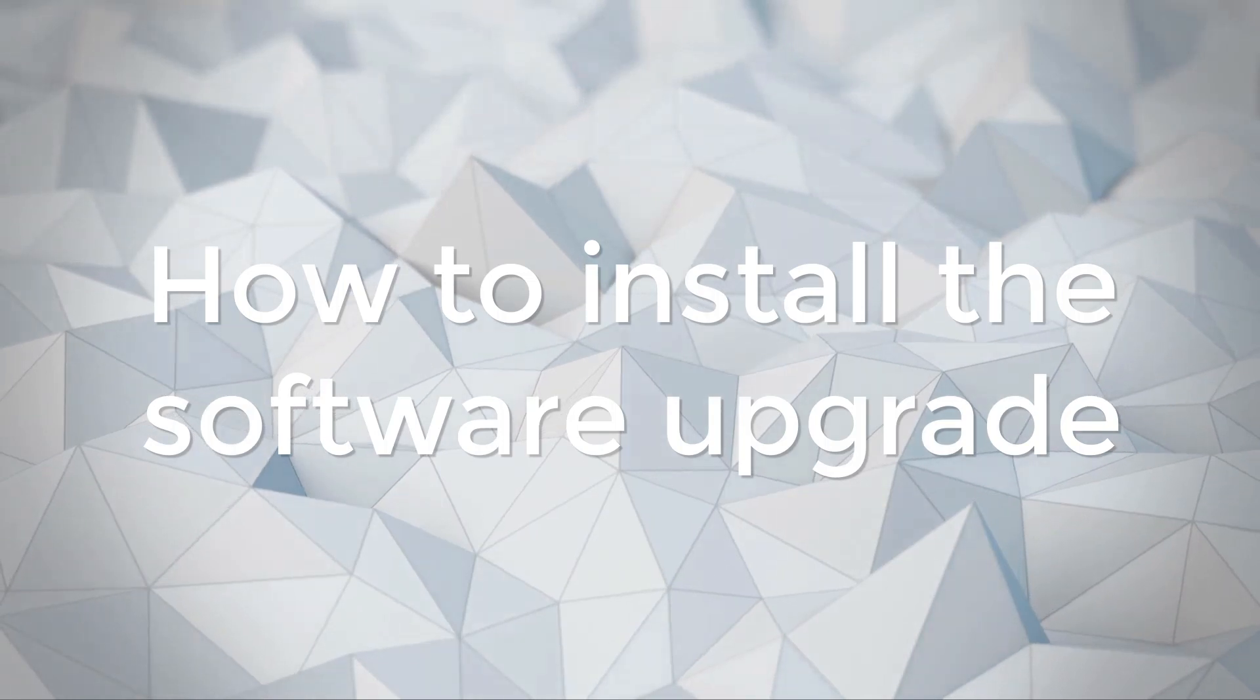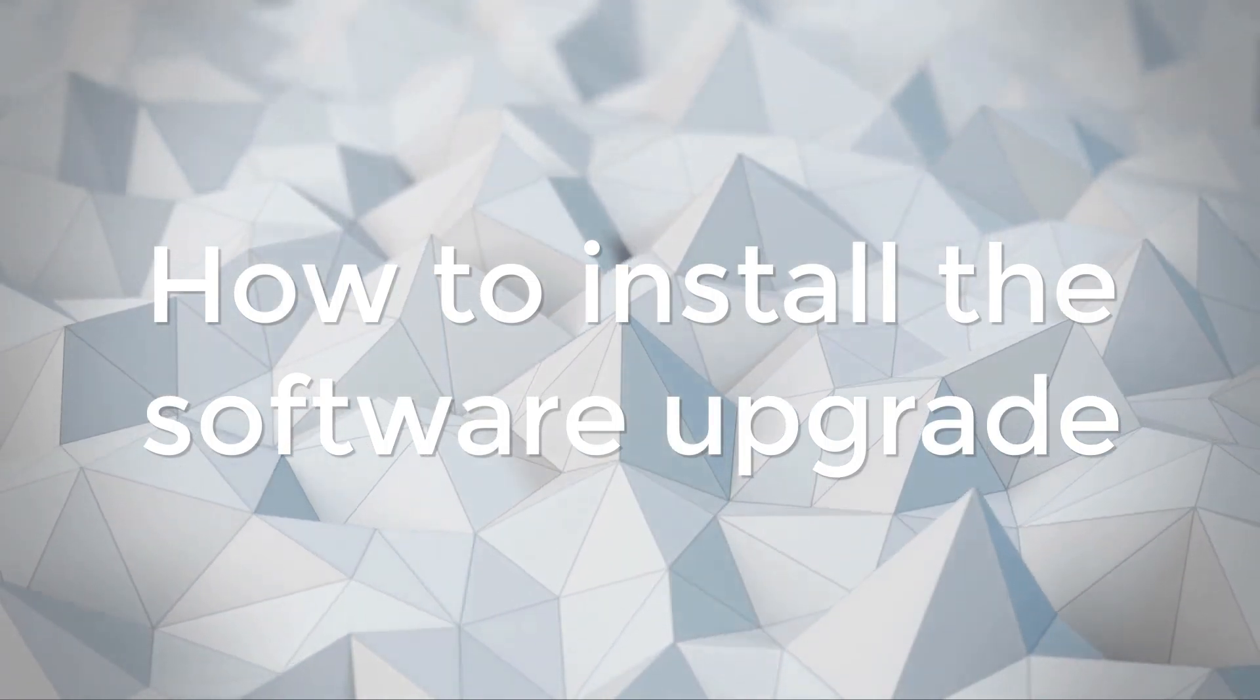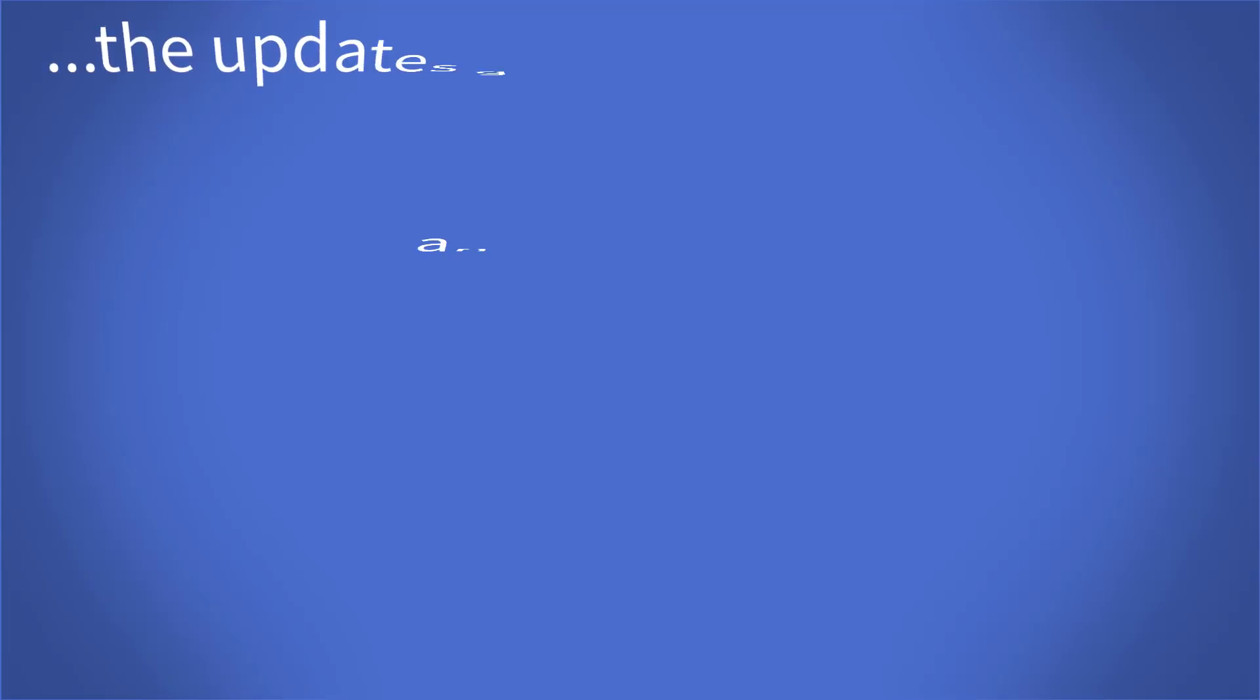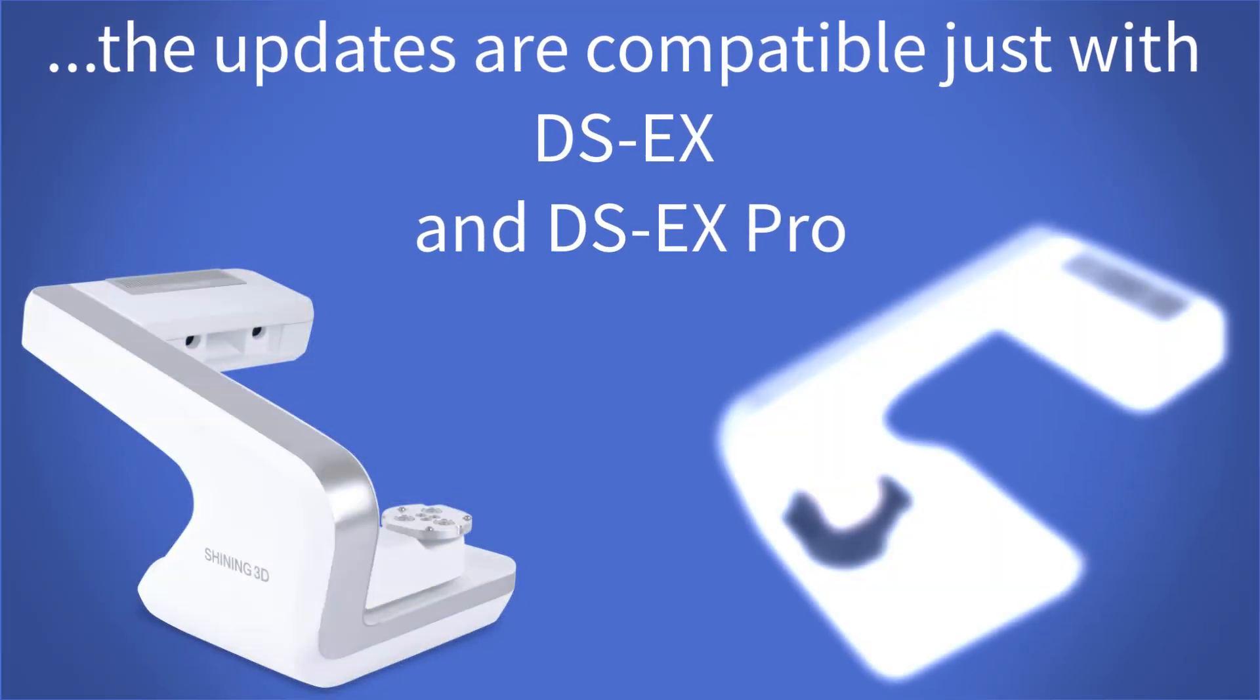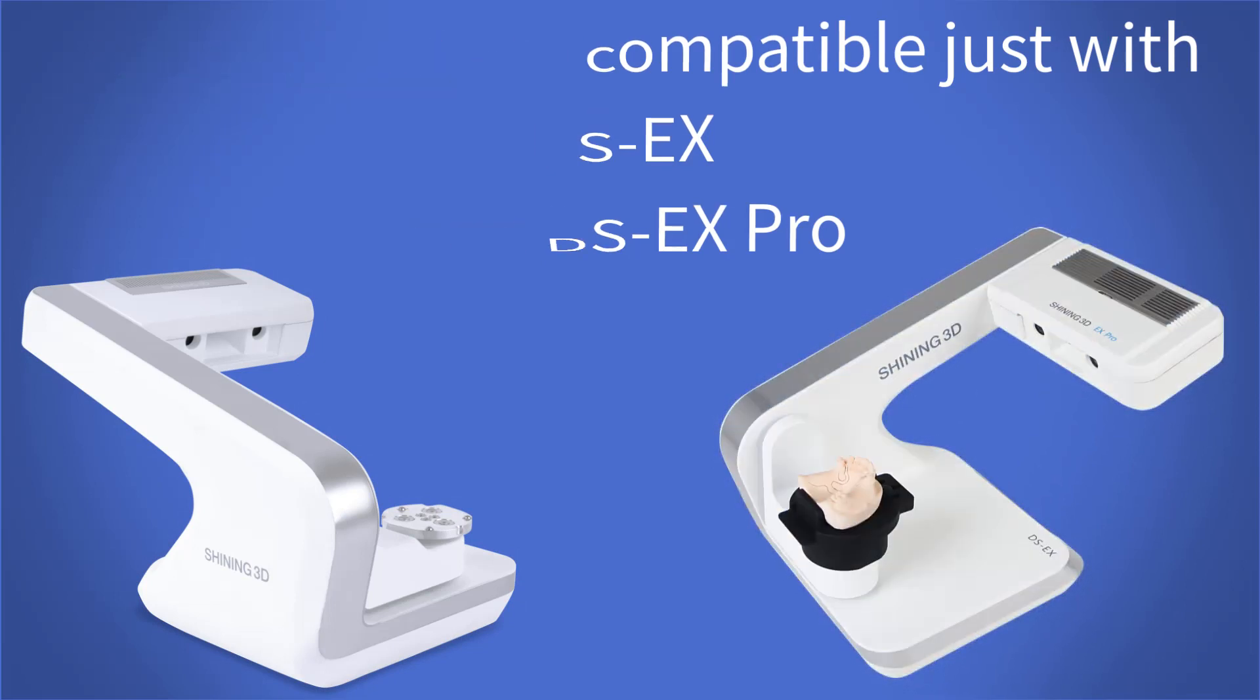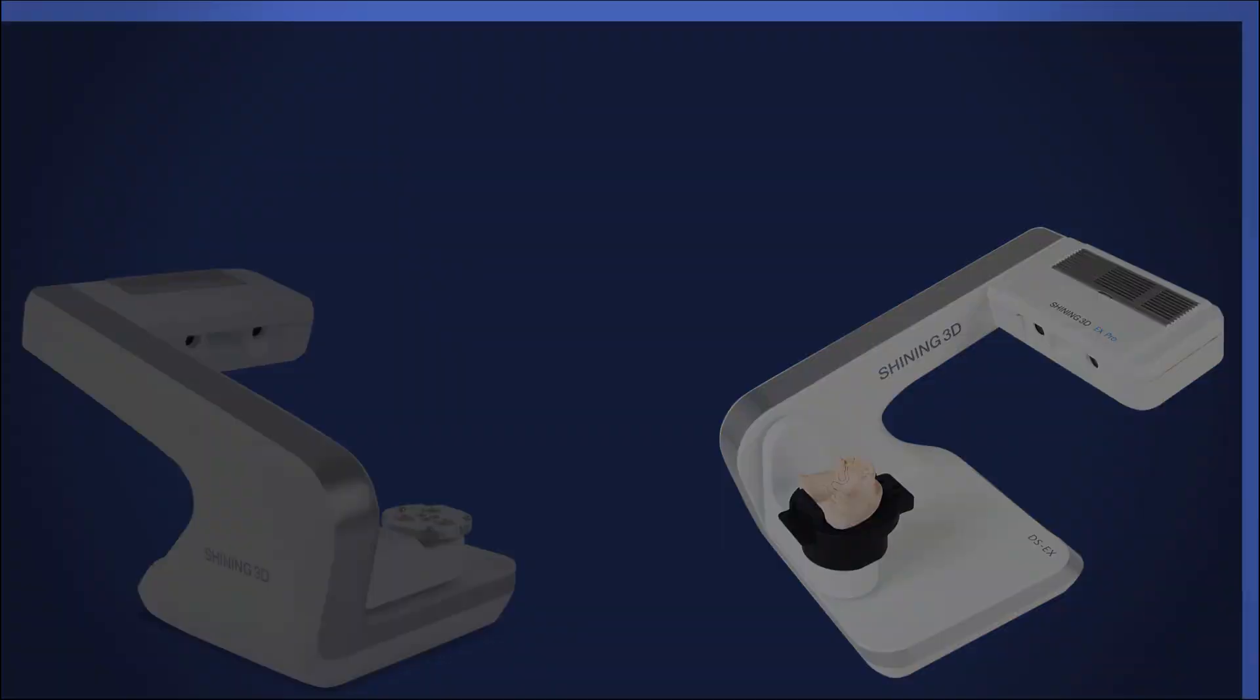How to install the software upgrade. The updates are compatible just with DS-EX and DS-EX Pro and of course with other dental scanners that Shining3D will release.